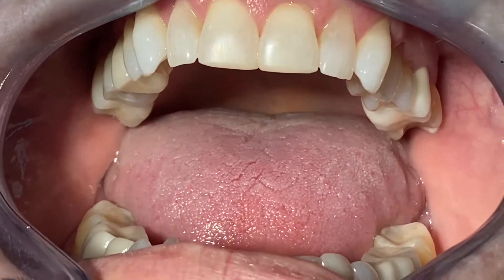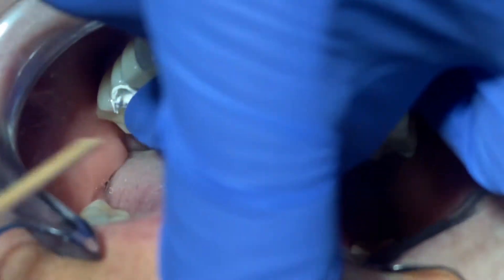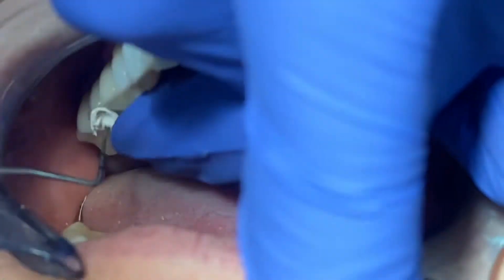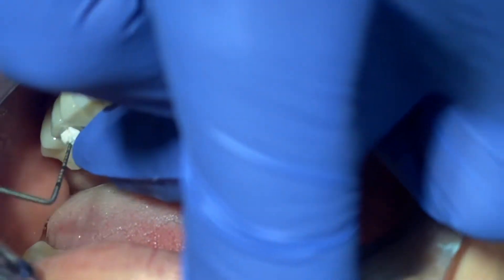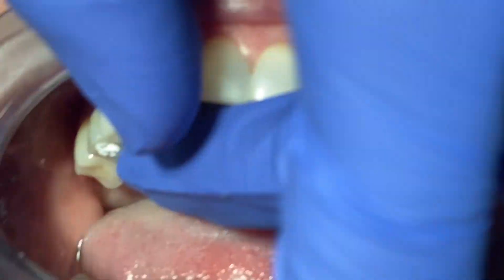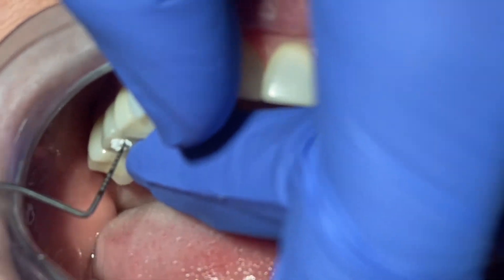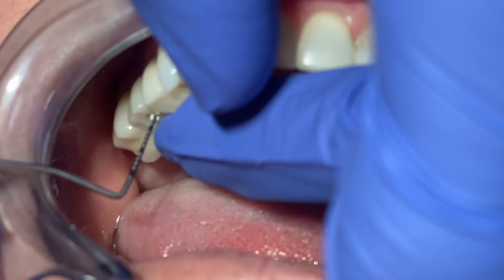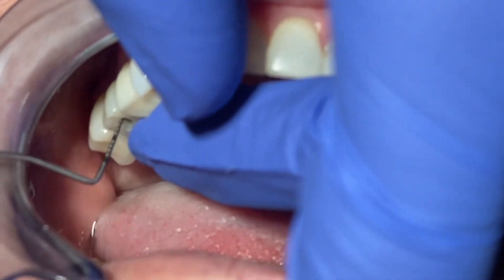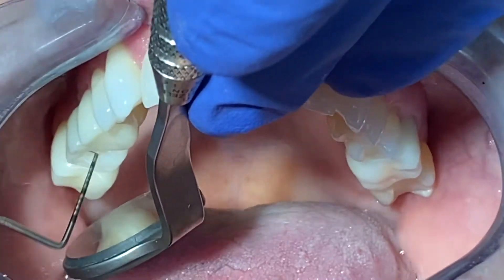Pretty much put the Teflon tape through the screw access hole and use a condenser or similar instrument to press it all the way in. You can use other materials — wax, cotton pellet — but we found that Teflon works best. It has the highest chance of properly sealing what you put underneath the composite.